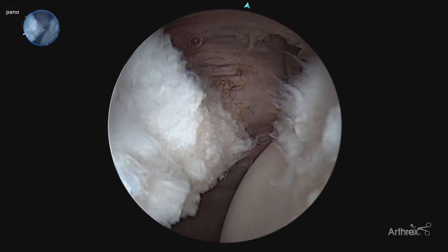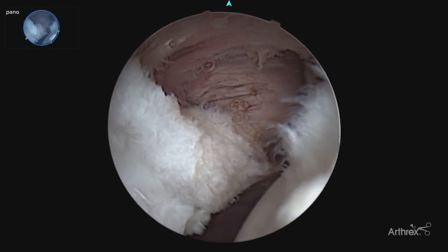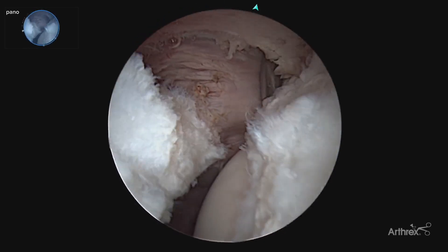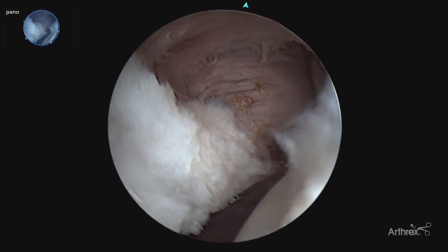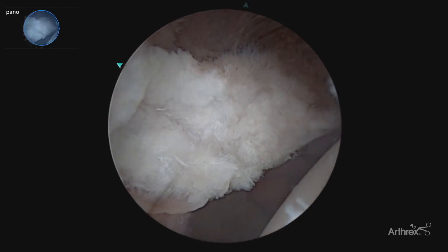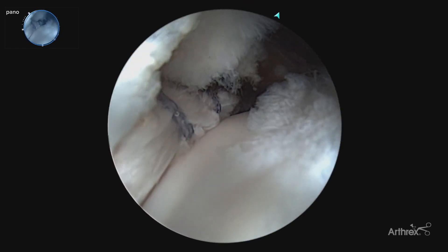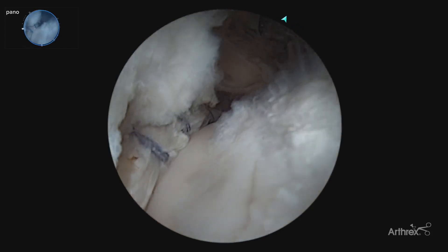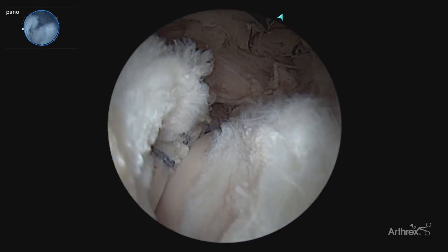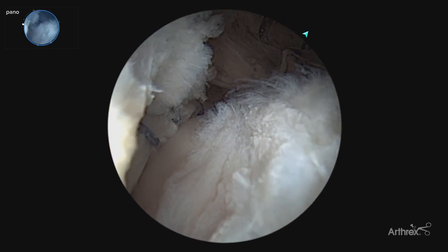We have now finished our interportal capsulotomy. We have been able to do this both safely and quickly, and we have nice clean edges that we can approximate with our capsule closure at the end of the case to preserve the native capsule. Here you can see our final arthroscopic labral repair. We have a three-anchor repair construct along with healthy cartilage and good clean leaflets with good edges to be approximated to repair our capsule for hip preservation.